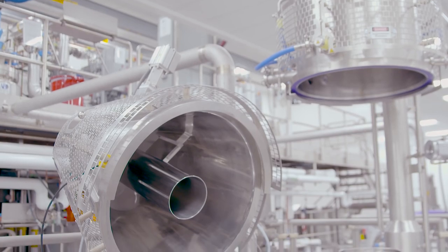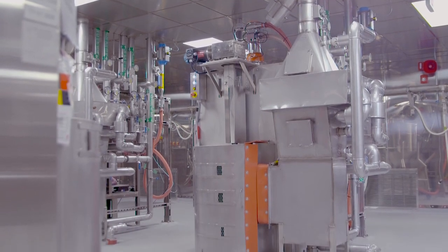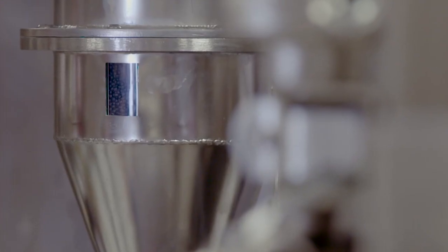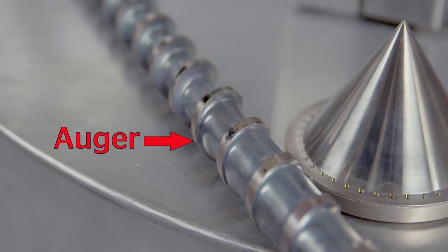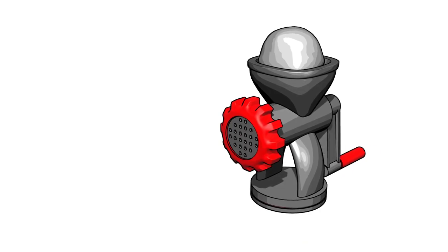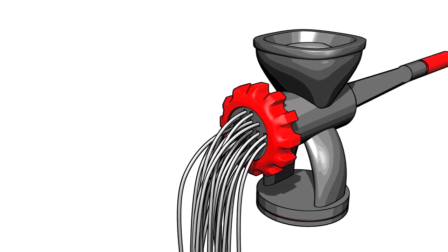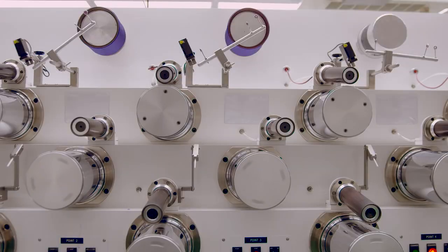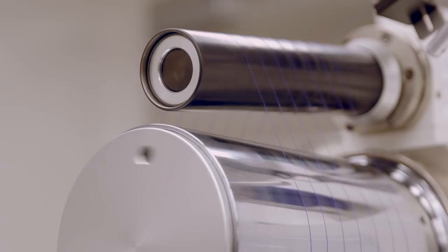Until now, nothing we've seen remotely looks like a thread. Extrusion is when the materials take shape, literally. First, the polymer pellets get shuttled downward through a vessel called an auger, which delivers them to a die that will extrude the polymer into fibre, similar to making spaghetti. The fibre is then stretched and rolled at different speeds. It is here that various properties like tensile strength are being set into the fibres.